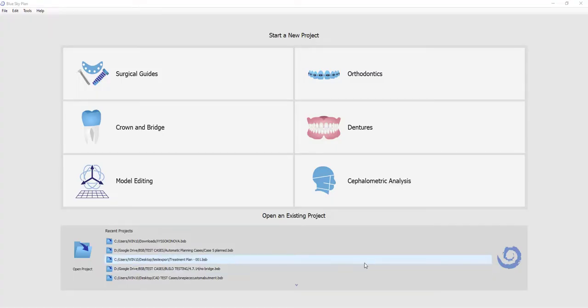This is Michael Saltzman from BlueSkyBio. In our newest software release, version 4.7 of the BlueSkyPlan software, we introduce new model alignment functionality.